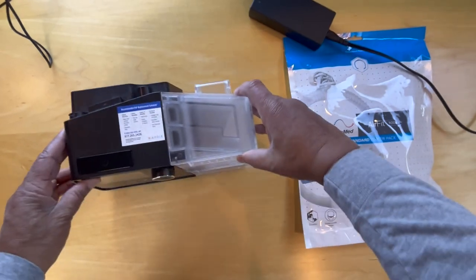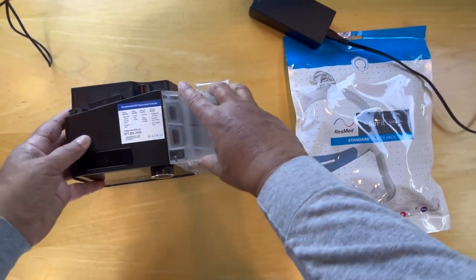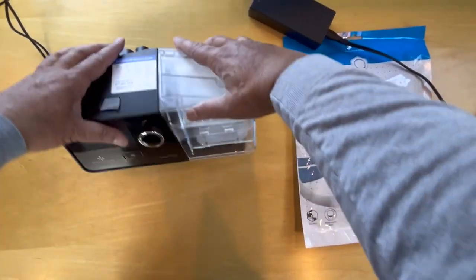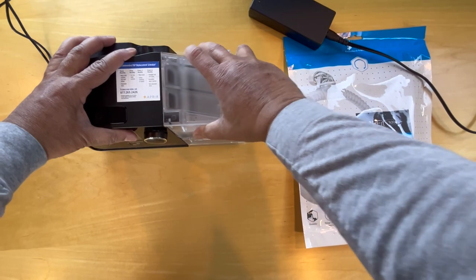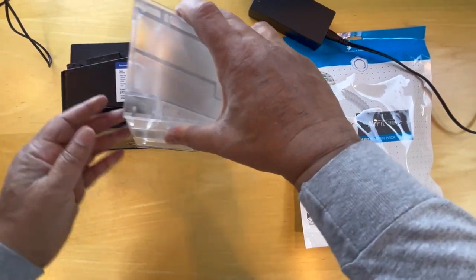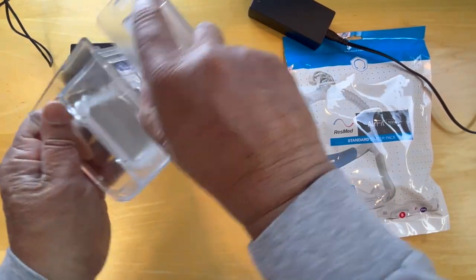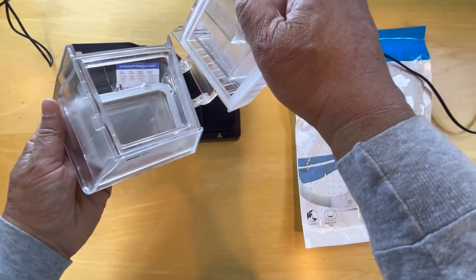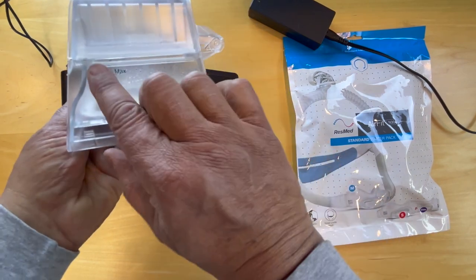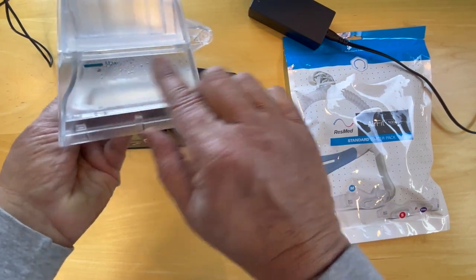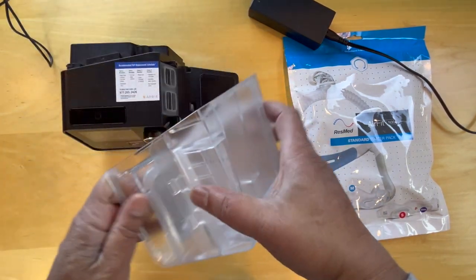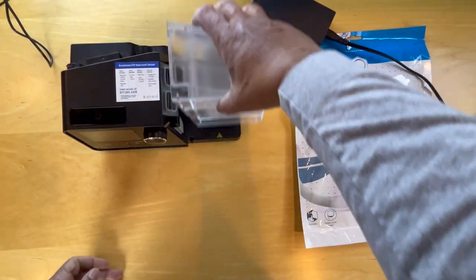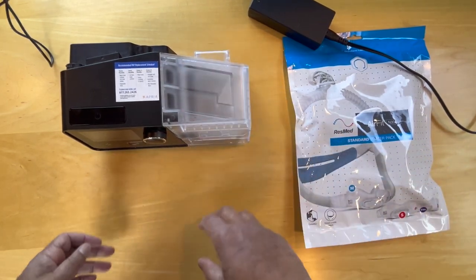So the ResMed has a water tank here. To open it we need to push down and pull it out. We open that and we add water up to the max line here. So put that aside. Push it back in.